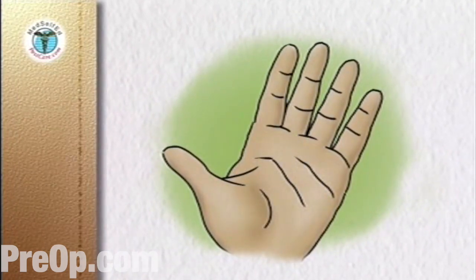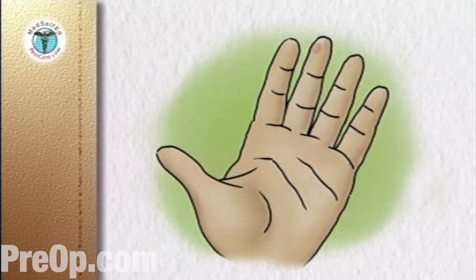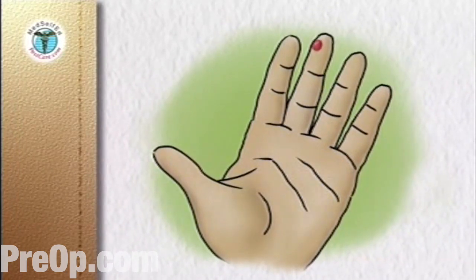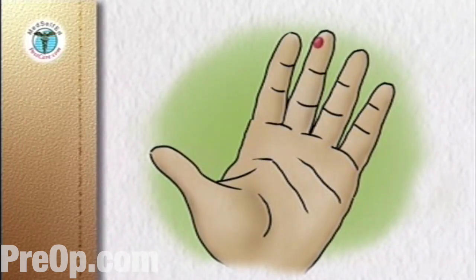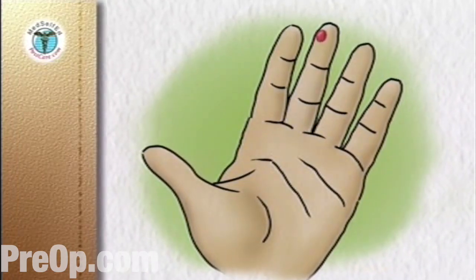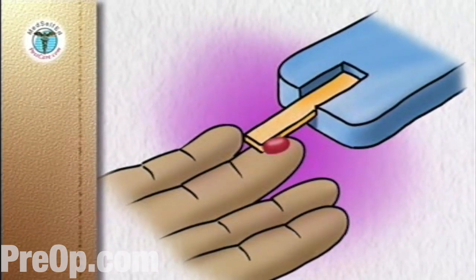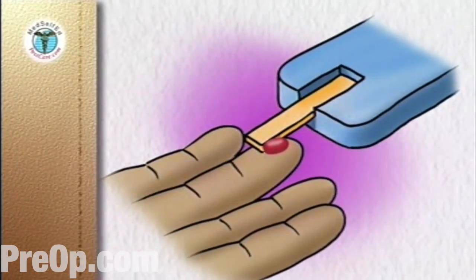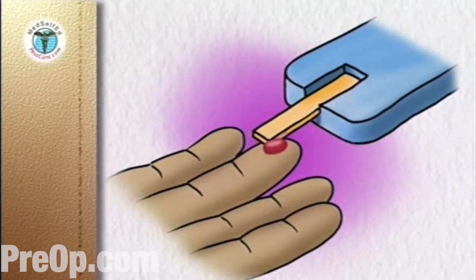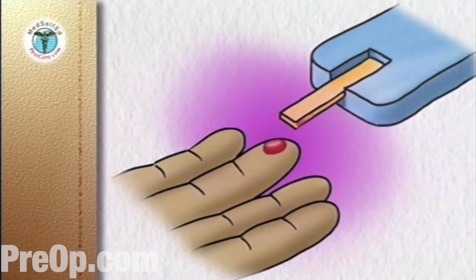After the puncture, remove the lancing device. If a drop of blood does not form on its own, stroke down the finger towards the puncture site without going as far as the site itself. Hold the tip of the test strip in the drop of blood until the meter tells you the test strip is filled, usually by beeping. Remove the test strip from the blood. Put the device and the strip aside until the reading is complete.